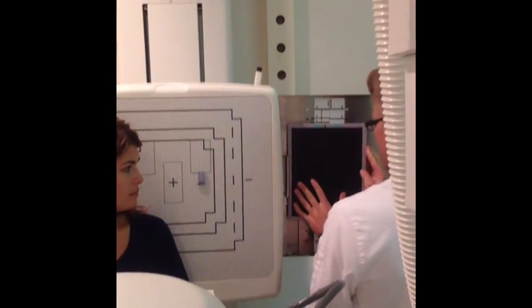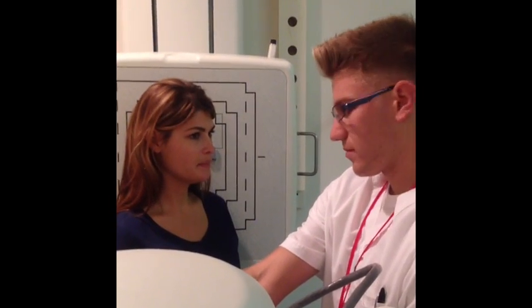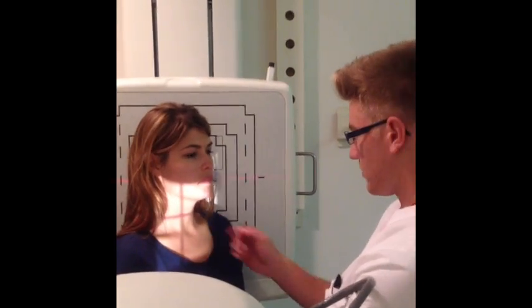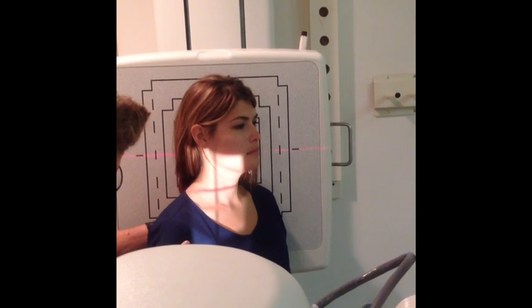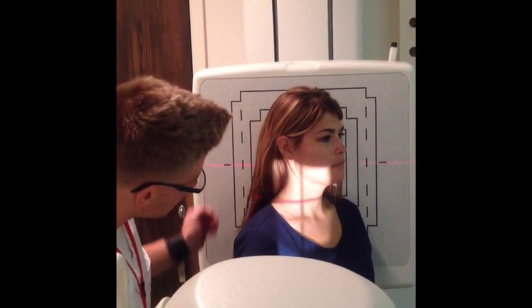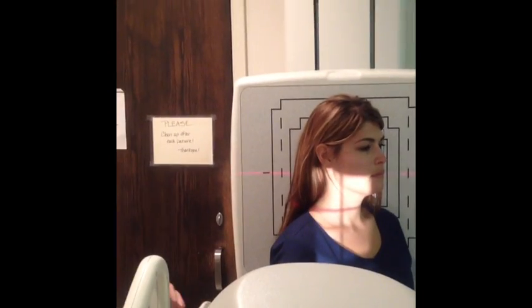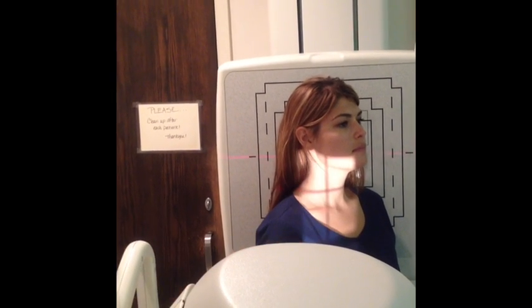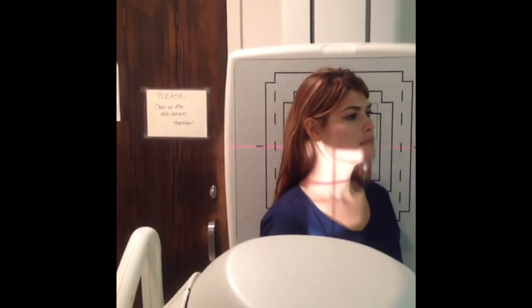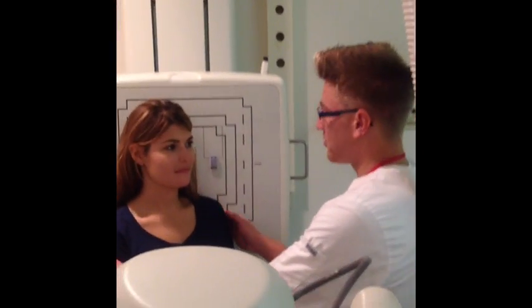Grab a new film. Once again, I'm at C4. Go forward just slightly — right there. This is looking for the intervertebral foramina. My marker's in the correct spot. Put your chin up for me, a little bit more — right there. And x-ray. I'm going to move her out of the 45-degree angle from the obliques.